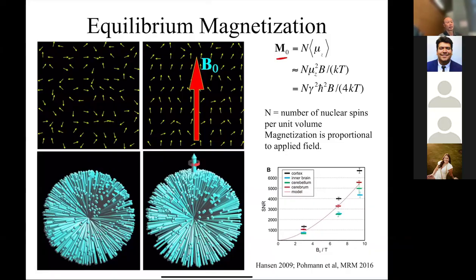But for your question, at least with the fields that have been used now, there doesn't seem to be an effect. Even with these higher field strengths, people don't seem to see any effects. And MRI has been around for, let's see, 30, 50 plus years. A lot of the people working in the field, like I've been in an MRI system probably hundreds of times, right? So it's unlike X-ray, where when X-rays came out, the people who were doing X-rays on themselves all started dying, right?